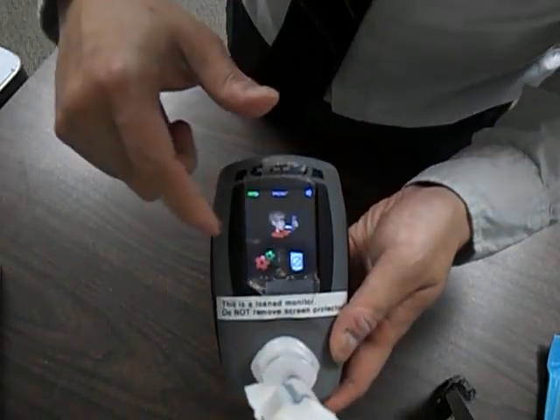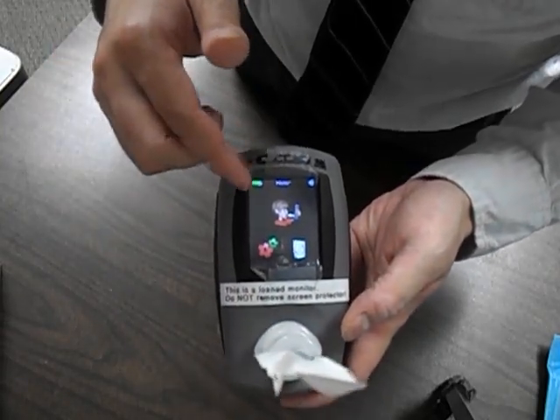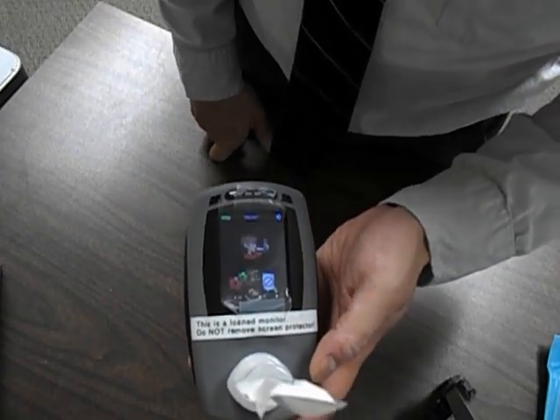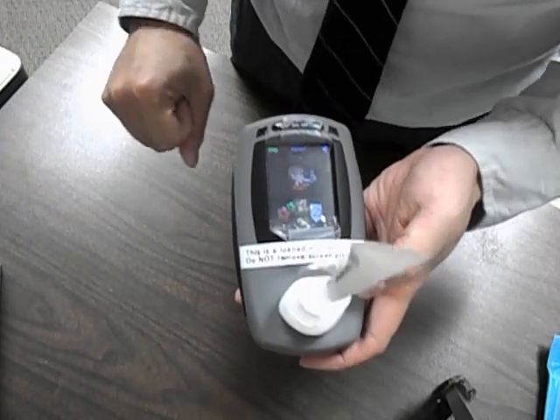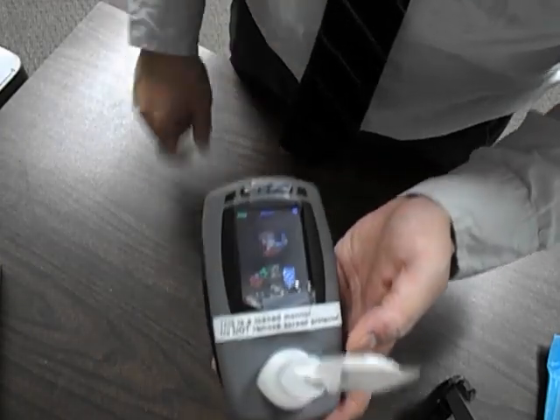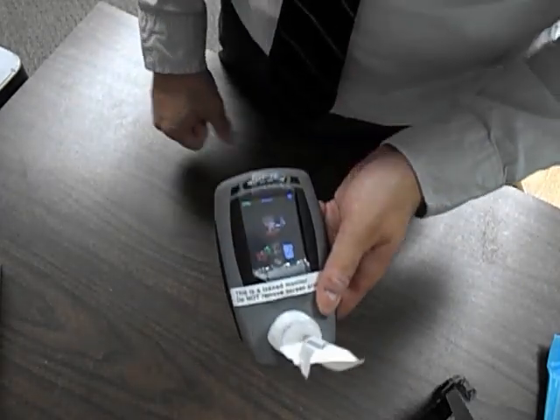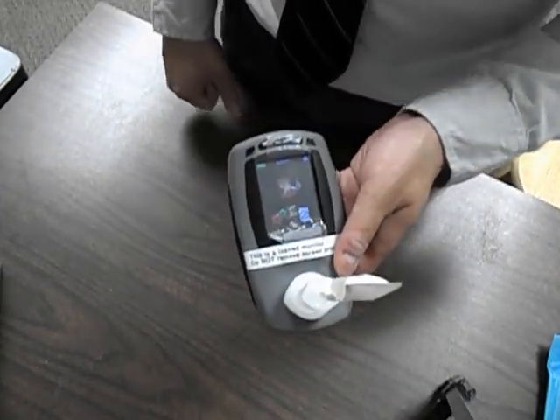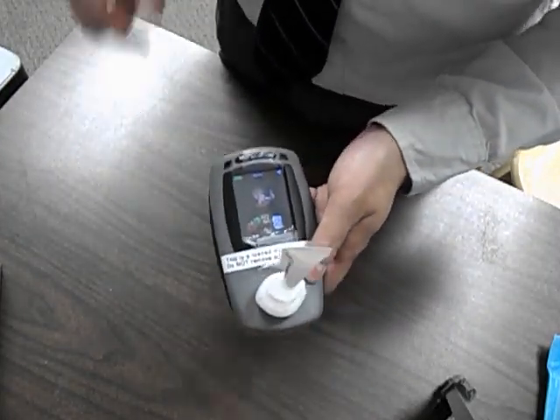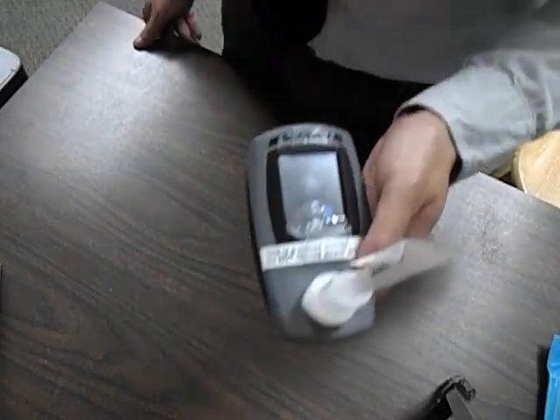Once you get started, the main menu will look like this. There's a guy here — we're gonna call Bob — and that's pretty much the only thing you need to focus on; the other two are just settings. For patients that have been here before, you don't need to explain what to do; just ask if they're ready and press Bob.